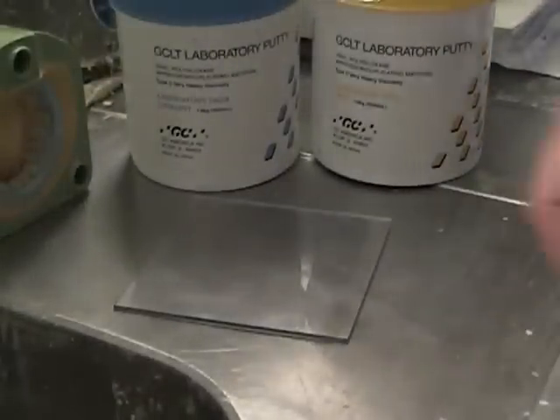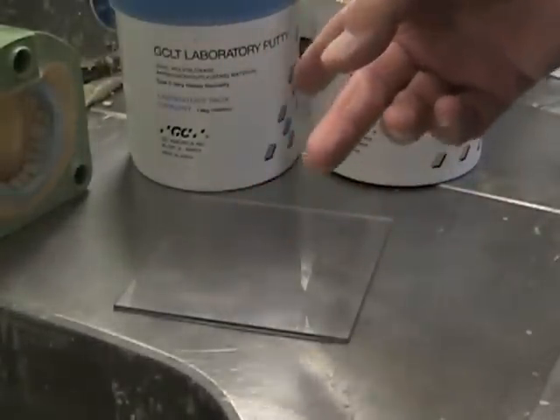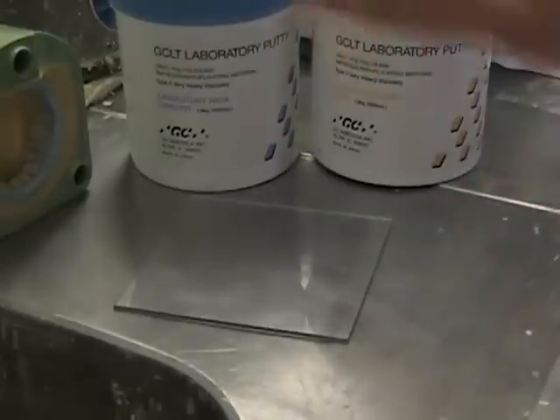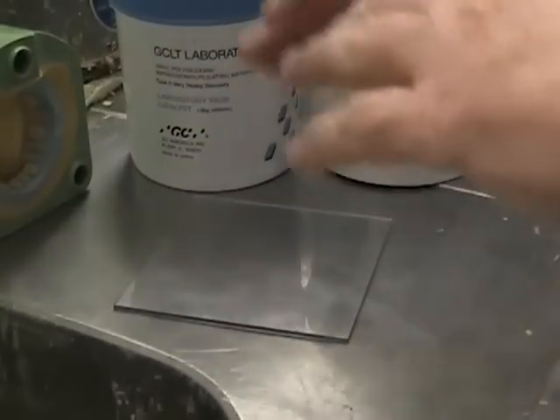So you use laboratory putty — I'm using the GC laboratory putty, the GCLT. I like the shore hardness; it works great. This video is not so much about the material itself, but about how to manipulate and how to use the material.